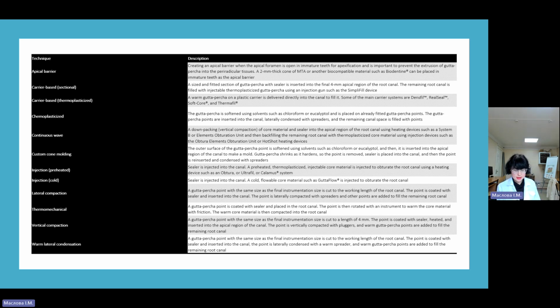The seal of the Ketac-Endo sealer was compared with AH 26 and showed a higher leakage, which was attributed to its fast setting, high volumetric shrinkage, and it has failed during testing. Support for the clinical use of Ketac-Endo is derived from patients treated by one operator.